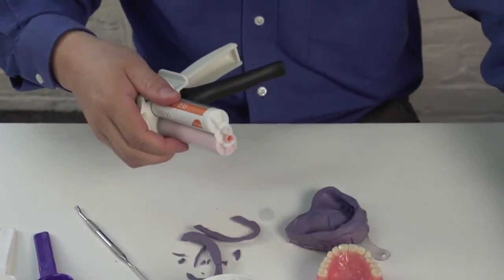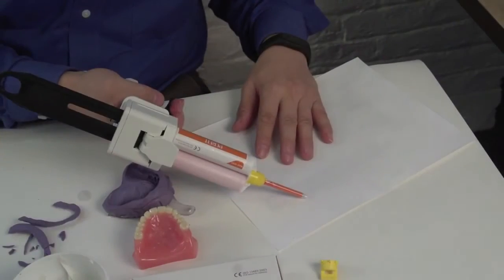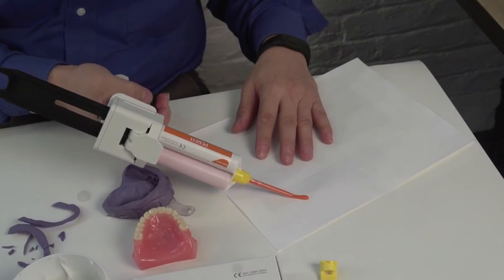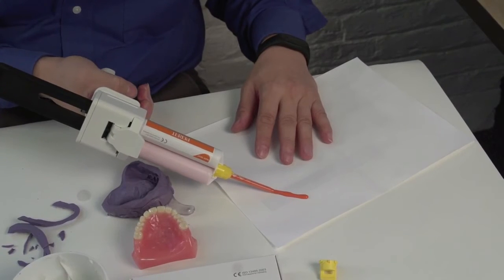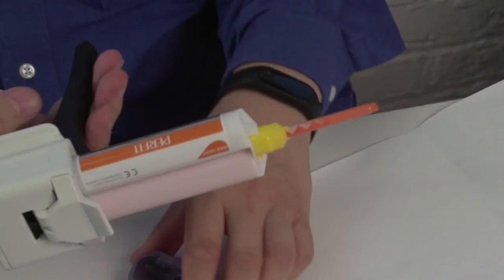Remove the cap and discard it. Use the mixing tip as the cap. Discard the beginning portion, 1 to 2 centimeters, of the light body impression material extruded by the mixing tip. Please don't reuse the cartridge cover cap. Instead, use the mixing tip as the cover of the cartridge after the second impression is taken.